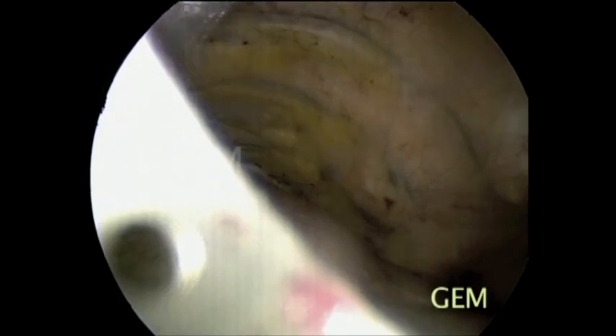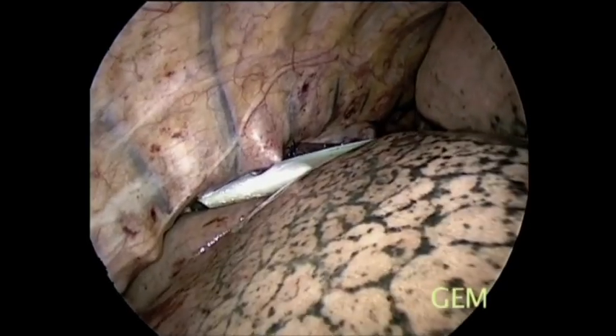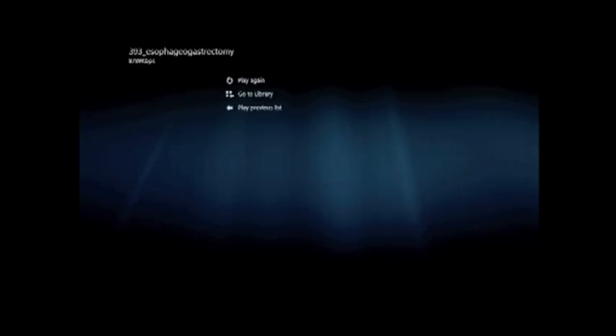Our primary series has already been published. After reconstruction, this is the chest view. We use three ports; occasionally we need one extra port. Thank you very much for patient listening.